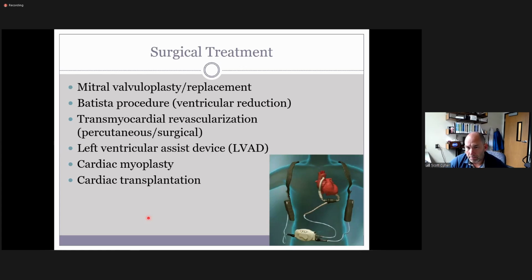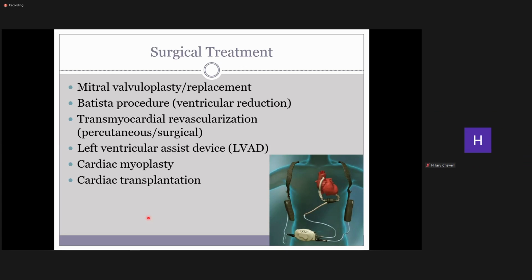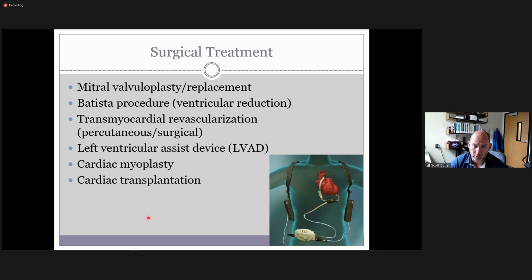Okay, and then in color, oh, I'm sorry, one more thing. When we slow down the blood flow, we possibly have what? Thrombus. So in 2D, you want to look in those pockets of areas to see that there is in fact not any thrombus. Is it important in these situations in particular that we see the endocardium really well? Yes. So in 2D we also want to look for blood clots.